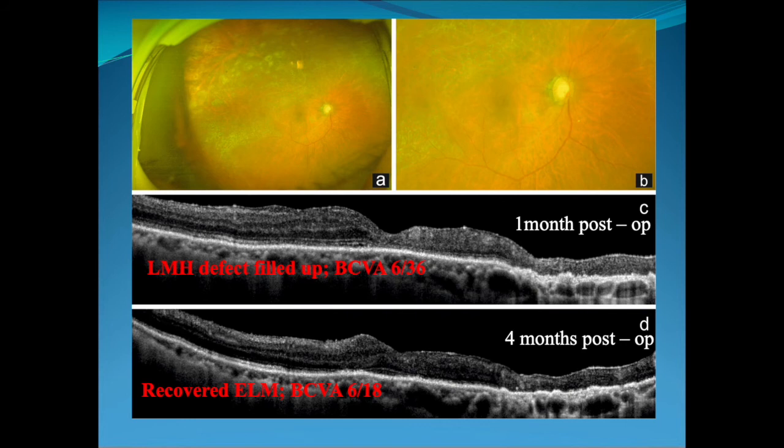Hence, we can see here a successful anatomical and functional outcome using the embedding technique for LMH in association with retinal vein occlusion.